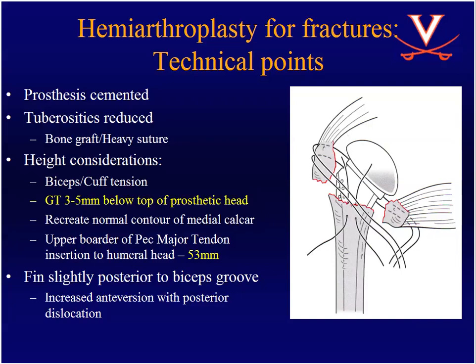The other thing is, where do you put your fin? Well, you put it so that the shoulder can get about 30 degrees of retroversion. Where is that? Well, typically behind the bicep groove for the main fin.